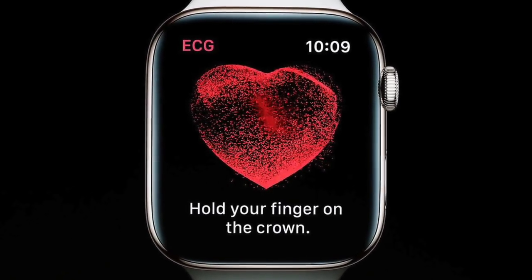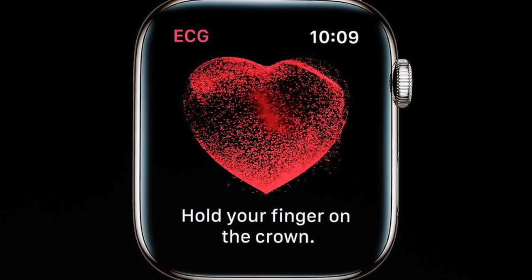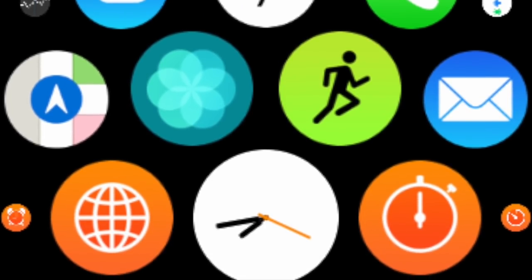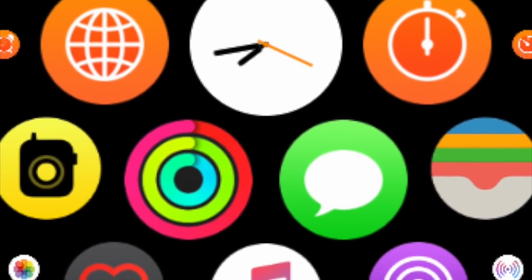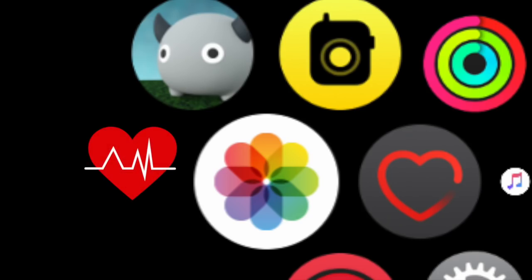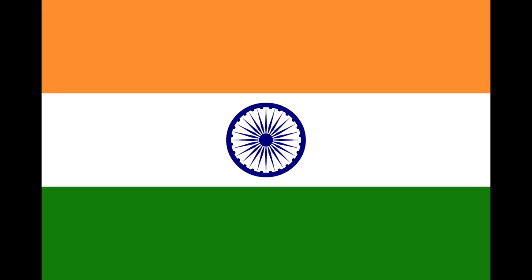A quick video on how to get the electrocardiogram app for your Apple Watch outside of the US after it is released later this year. When you are in the US, your ECG app will automatically update to your home screen as soon as the app is released. However, in many other regions you won't see the app automatically after the update because of regional restrictions.